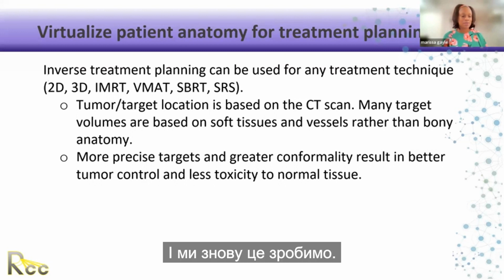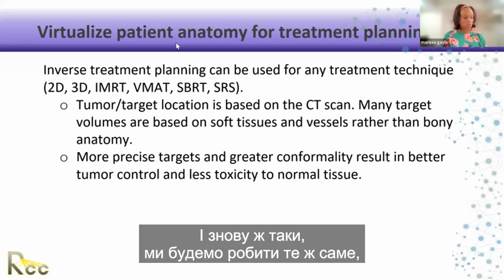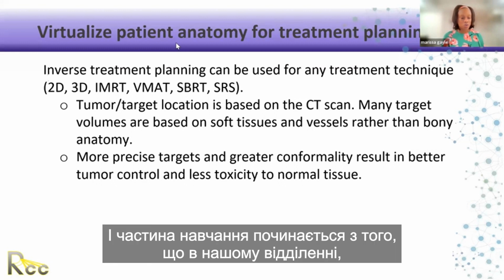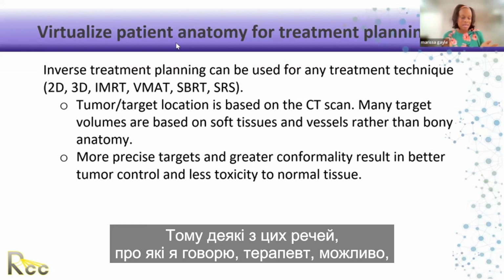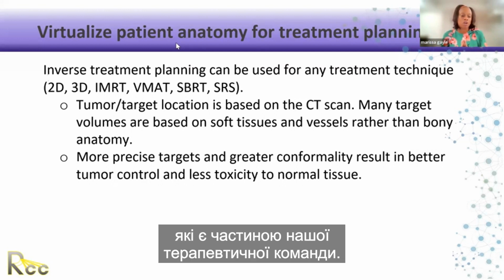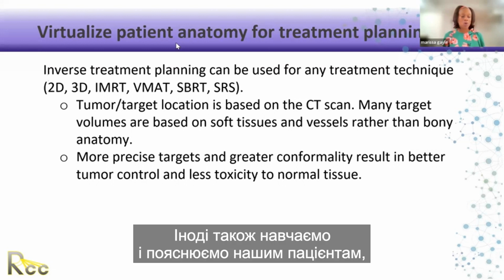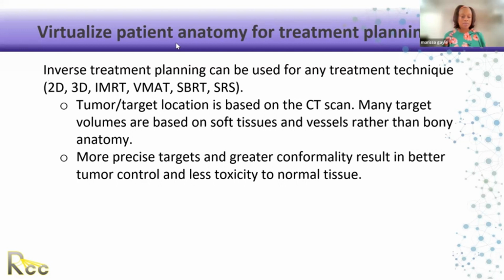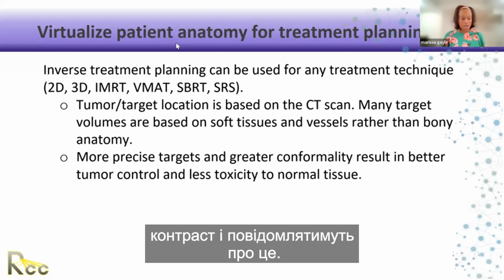And again, we're going to do the same things that we did before. We're going to make sure that the patient is educated. Some of the education starts with, in our department, like I said, I'm in a large hospital, so some of these things that I'm saying, the therapist may have to do, but at my job, we do this in conjunction with other people that are part of our therapy team. So for one thing, we have the nurses sometimes also educate and explain to our patients what to expect during the CT simulation. Depending on the site, the nurses will also place the IV line and let the patient know about the contrast.